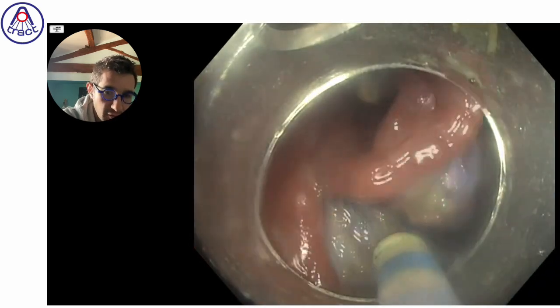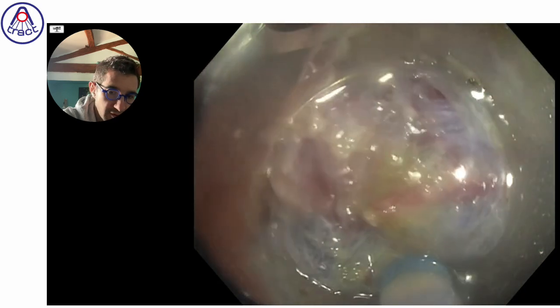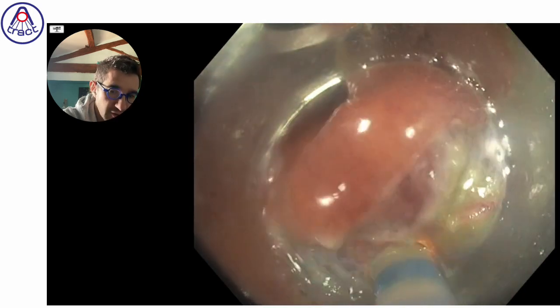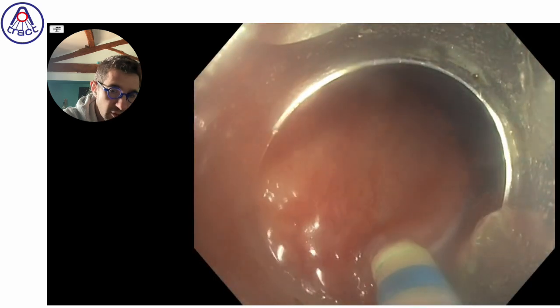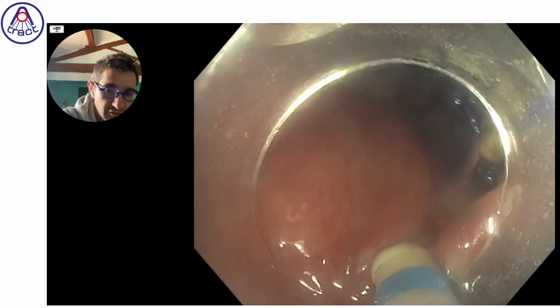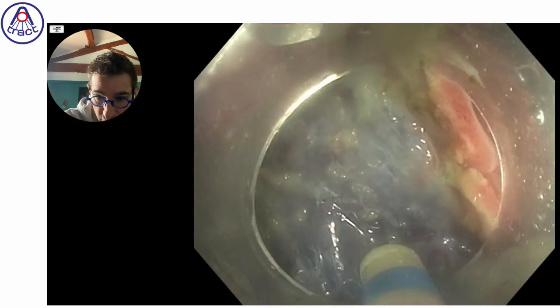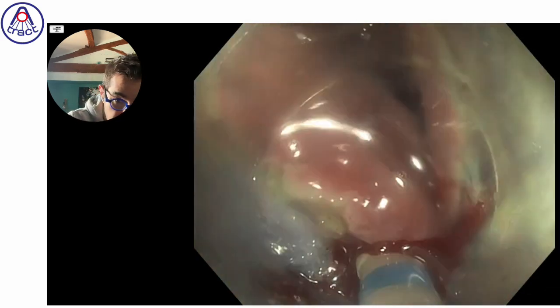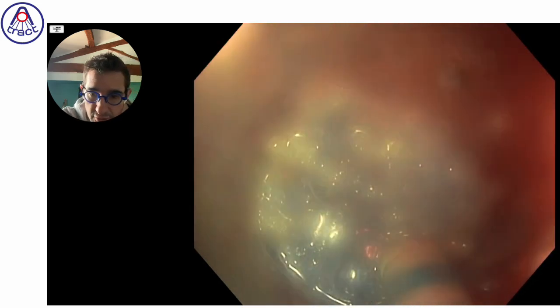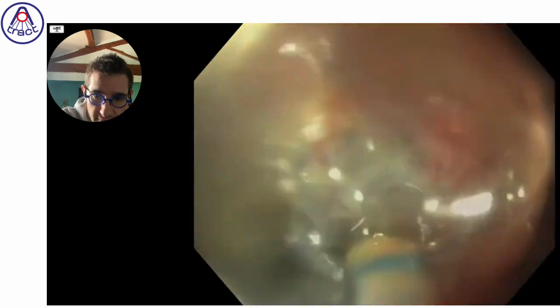So once again, using a knife with reinjection will change your strategy, because you are not obliged to inject a lot at the beginning and to inject macromolecular solution, because you have the capability to re-inject very, very frequently thanks to the device. We will see here the washing function.